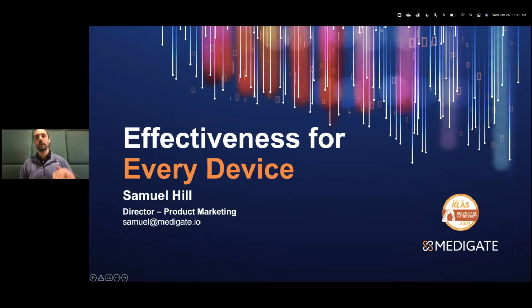And so the risk score is fluctuating based off of the different components. Are there known vulnerabilities for that device? Is Urgent/11 an applicable vulnerability? Log4j, obviously everybody's talking about Log4j. Is that applicable to this device? And what can we do about it? What should we do about it based off of those things? And so you can customize the risk score framework based off of how your organization would like to assess risk and the specific characteristics of risk. And I'd happily dive into more of that, but we are running a little bit out of time, but I'm happy to dive more into that with anybody that would like to see that specifically.